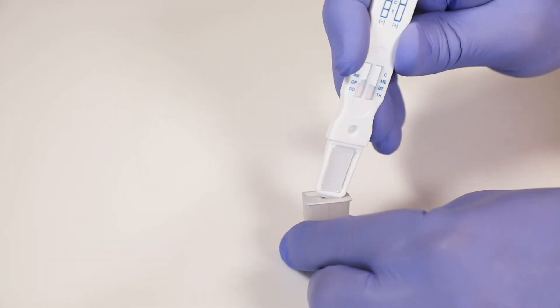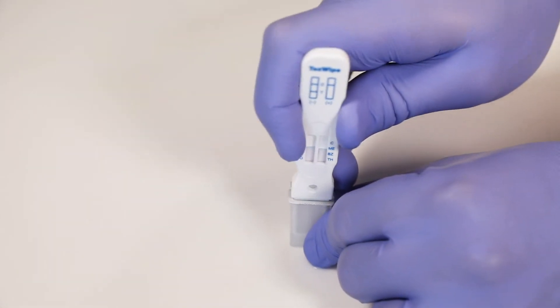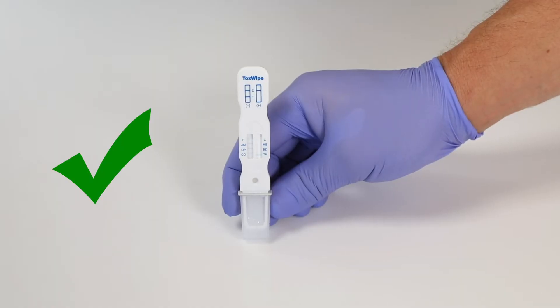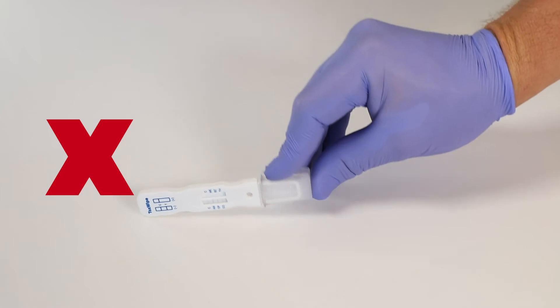Using the front corner, push the device until fully inserted. Hold the device upright or lying down, but do not place it upside down or on its side.